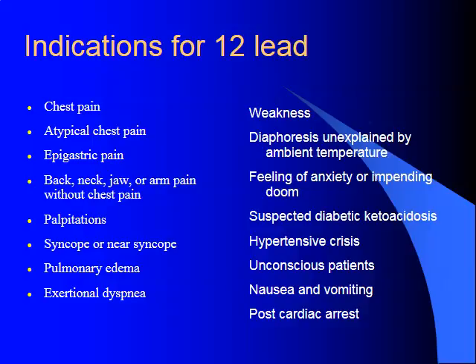We'll be doing them on patients that have generalized weakness, diaphoresis unexplained by ambient temperature, feelings of impending doom, suspected DKA, hypertensive crisis, unconscious, unresponsive patients, nausea and vomiting, and post-cardiac arrest.